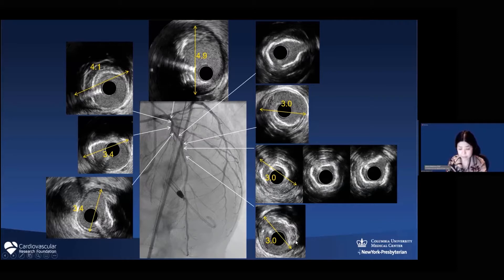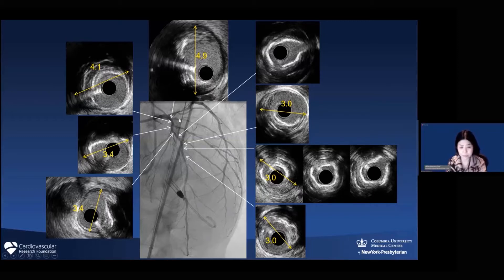Now you can recognize that even though geographically it looks like quite diffuse disease, vessel tapering is really determined by the side branch locations. So whenever you see a diagonal branch, you should recognize that the vessel diameter will change in a very consistent way.